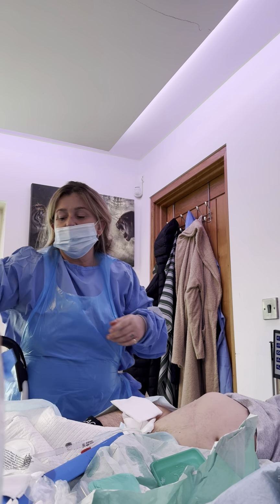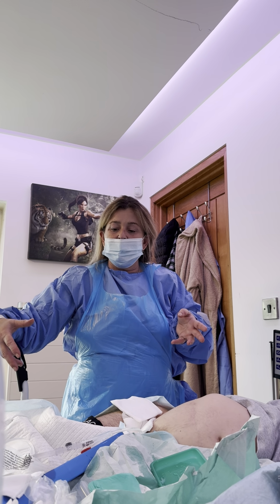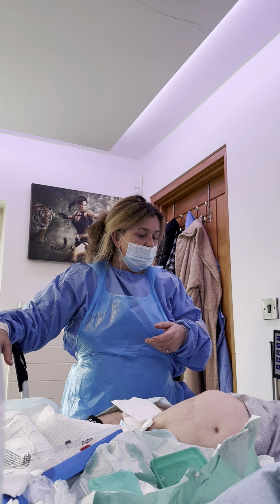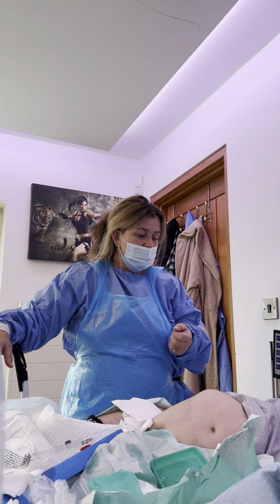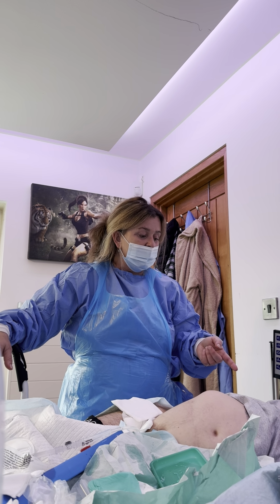we use this rather than the silicone ones because the silicone ones have been stuck inside. No, that's where you're wrong. The Roosh have been stuck inside as well. Why am I wrong? The silicone and the latex ones have been stuck inside. Silicone is what we use. Yeah, they're the silicone. I'm saying the old silicone ones that we used. Latex is what gets stuck.